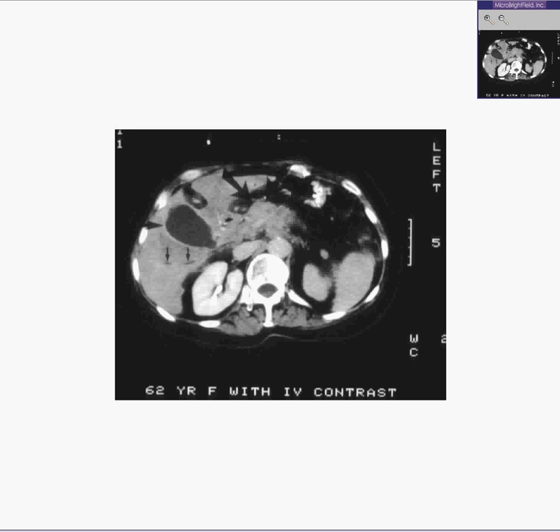And indeed, this is what we do have. We have a carcinoma of the head of the pancreas. And here is the gross specimen.